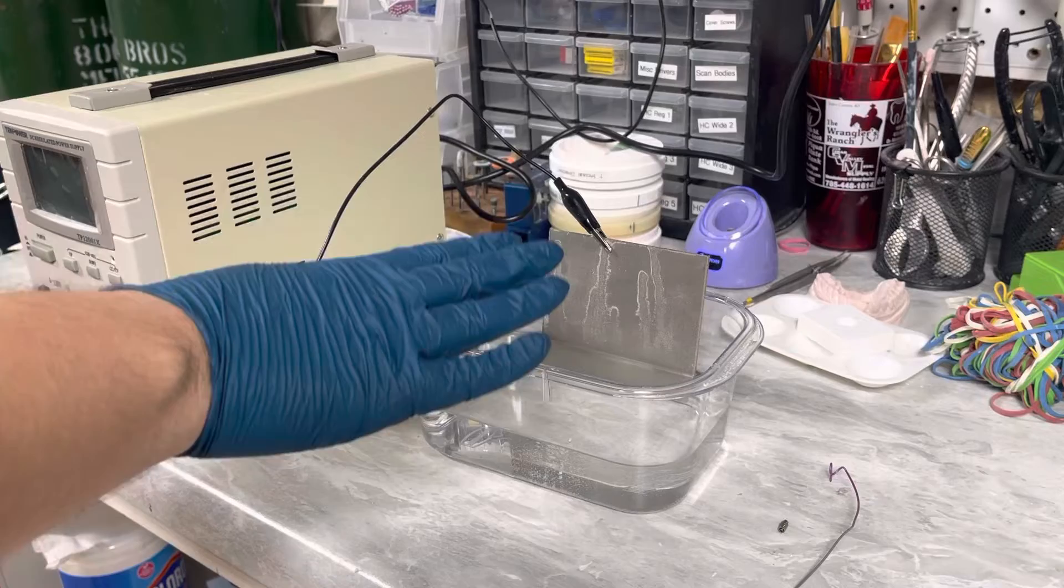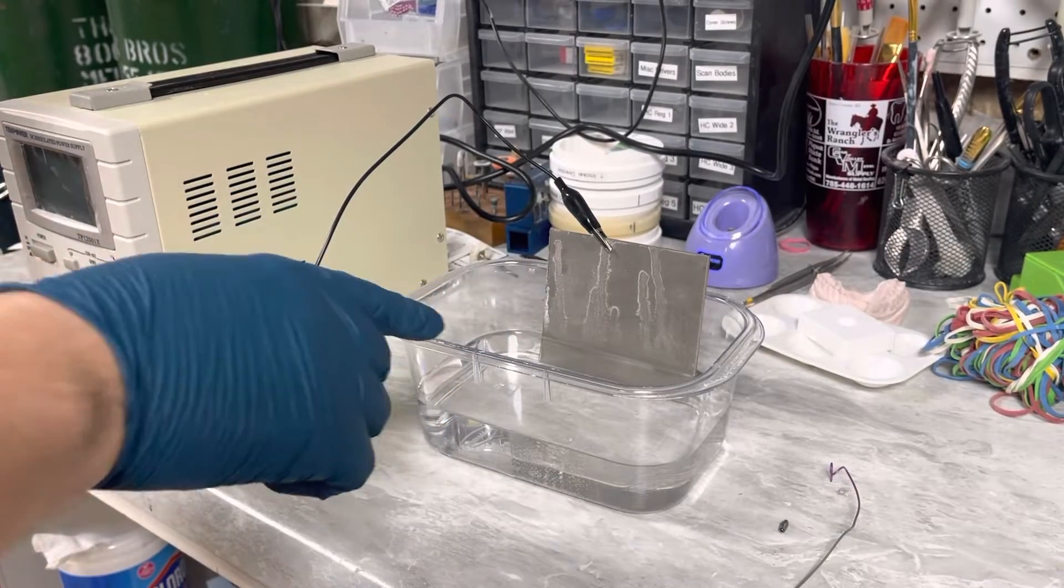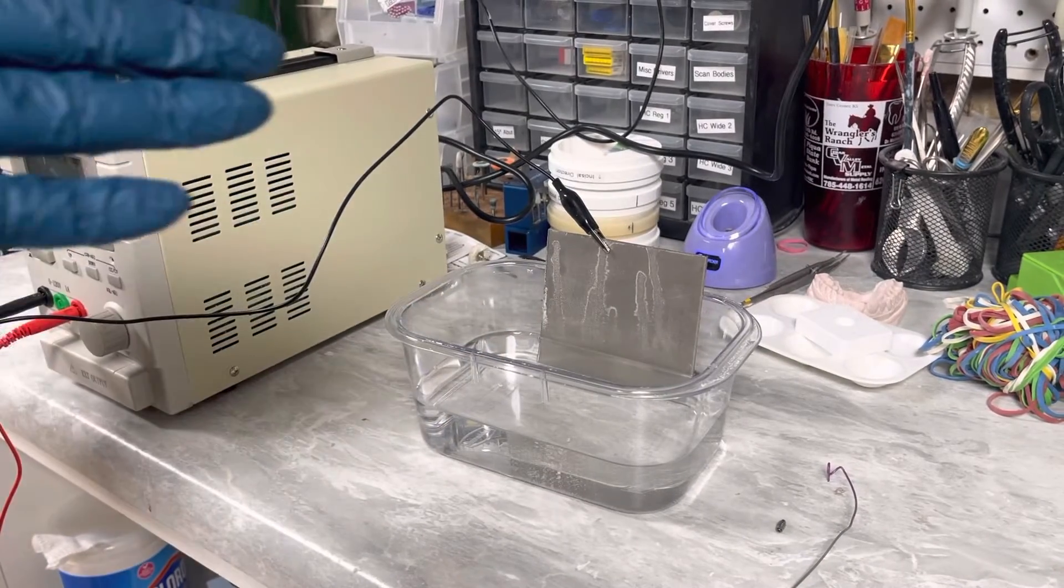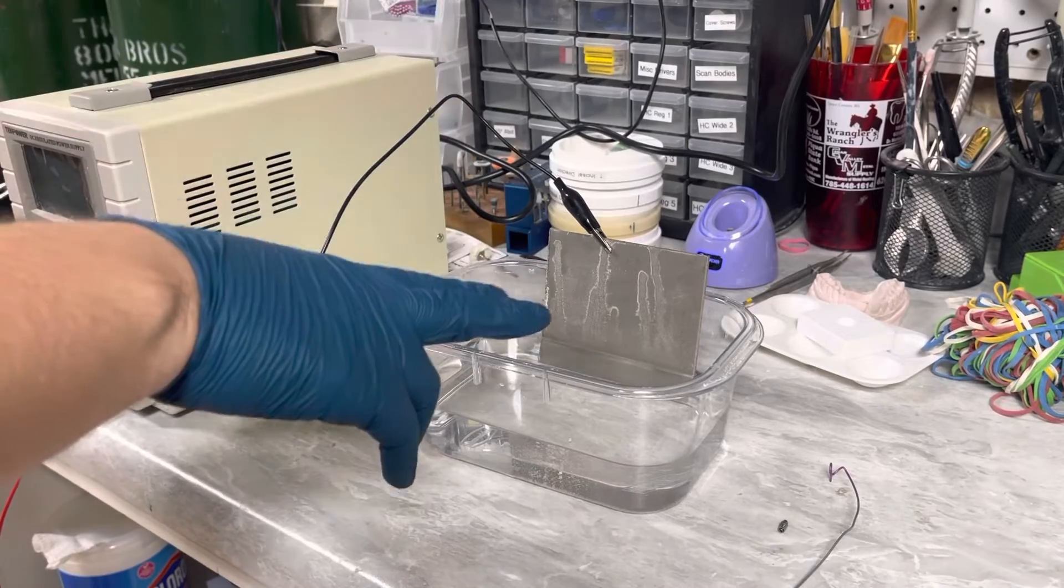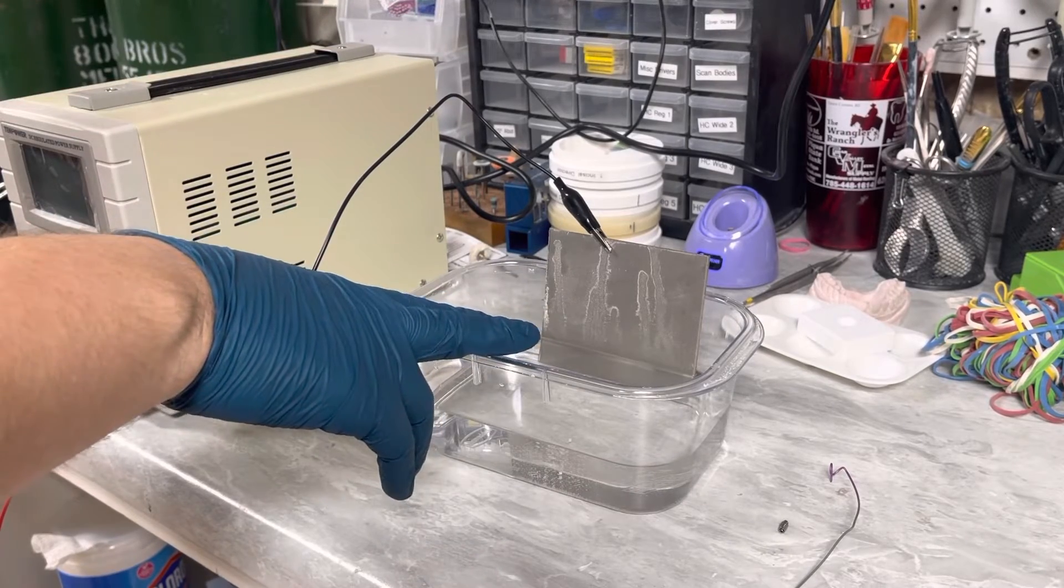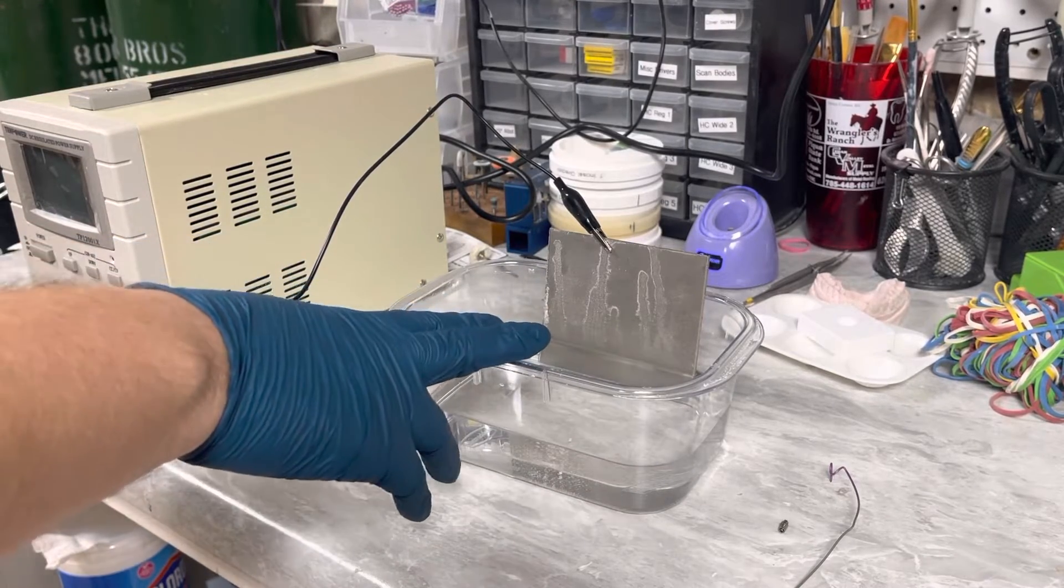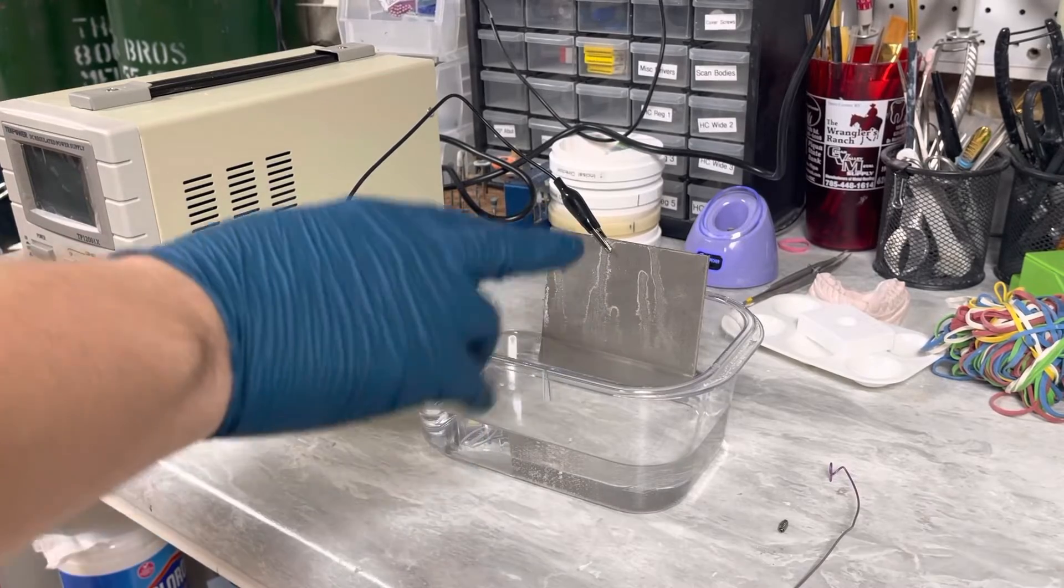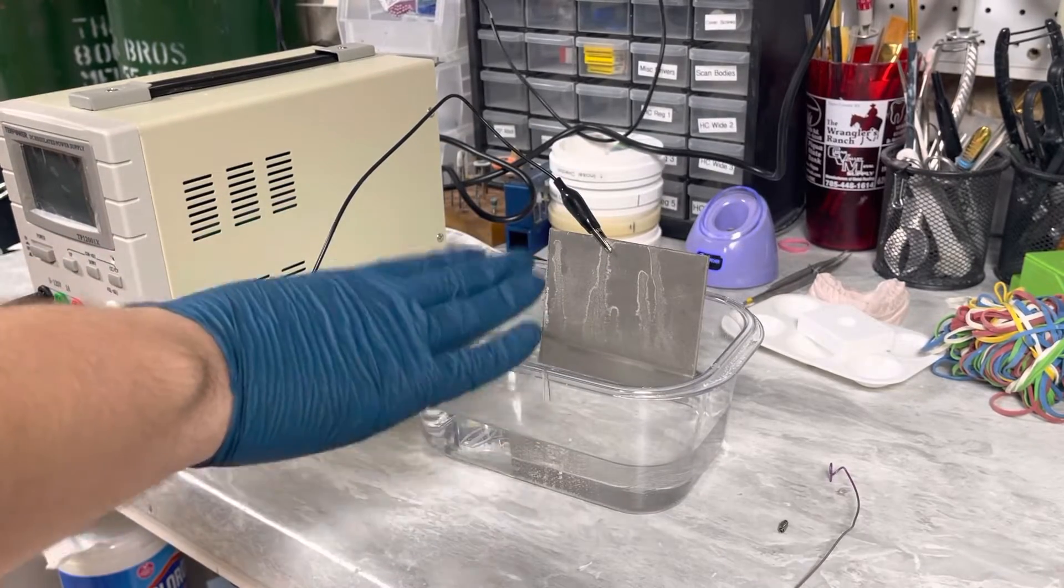First thing first, you need a container with an electrolyte solution. So I just use water and I put about a quarter cup of baking soda in it and dissolved it, and so I made a basic electrolyte solution there.